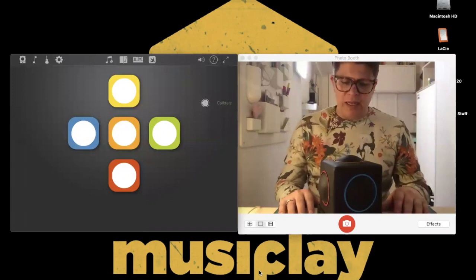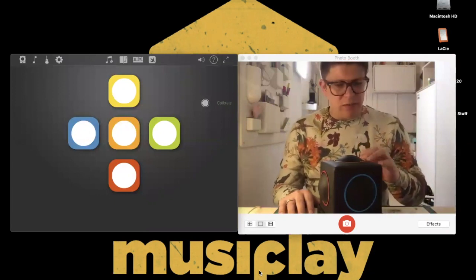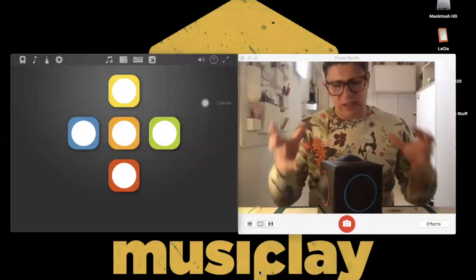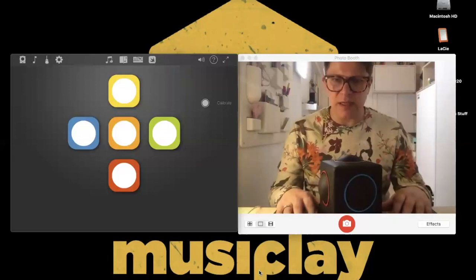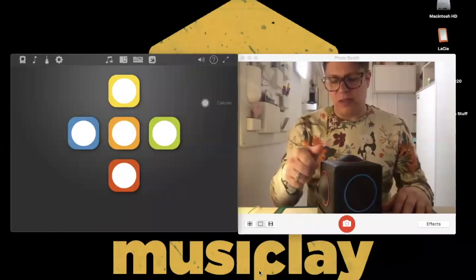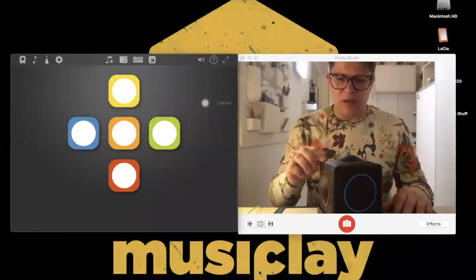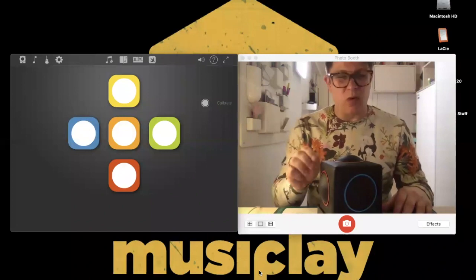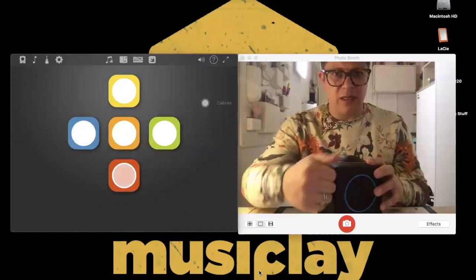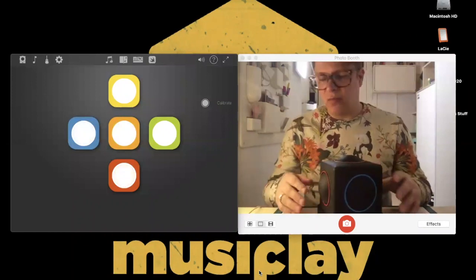And so it is not susceptible to drool or fluids, but don't immerse it in water. But the sensors are all bedded deep inside, so they're safe. This Skoog is a newer version than the old white one, which was susceptible to biting. This has a very tough skin on it. Here you can see, and that's really quite resistant.